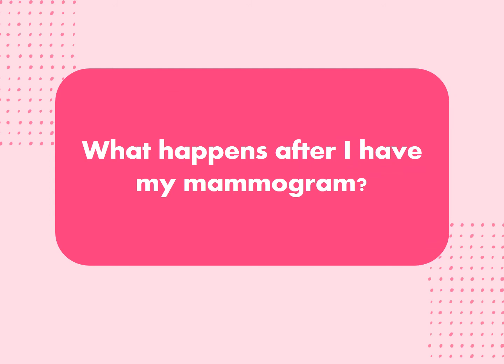So what happens after you've had your mammogram? You've had your mammogram, we send you on your way. We'll tell you that you'll get a letter in the post in 2 to 3 weeks with your result. What happens when your mammogram comes back to Elton is that it's read by 2 different film readers on 2 separate occasions. This can be a consultant radiologist, a consultant radiographer, or an advanced practice radiographer, and on 2 separate occasions they will view your mammogram and form an opinion on it.